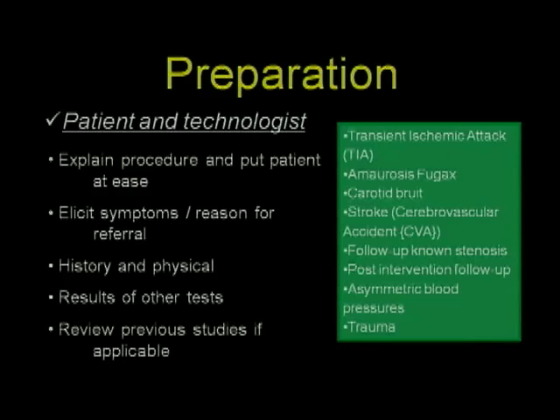I do believe it's important to go over the results of other tests, whether they be previous duplex scans in other facilities, or to find out the results of contrast arteriography or MRAs or CTAs that may have been done previously. And I believe that this is important because your report really should be clinically relevant, and if that requires a comparison to a previous report, I do believe that this is in order.